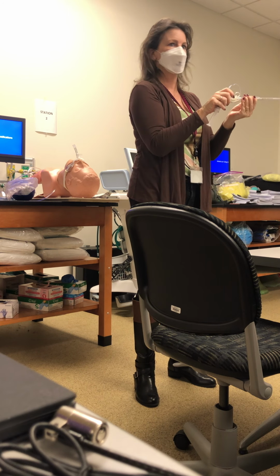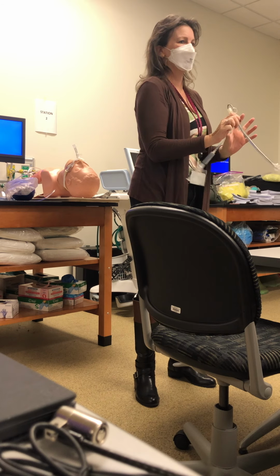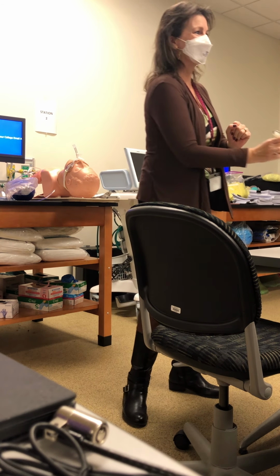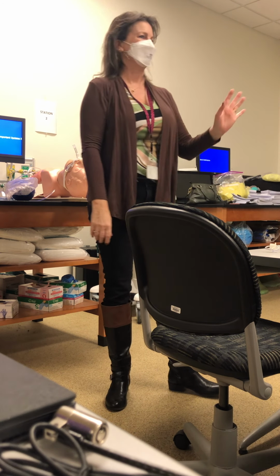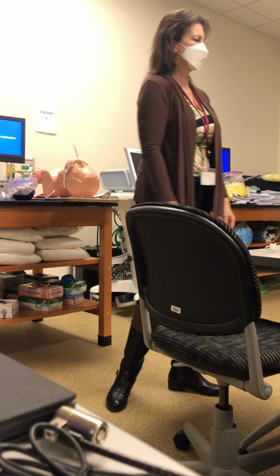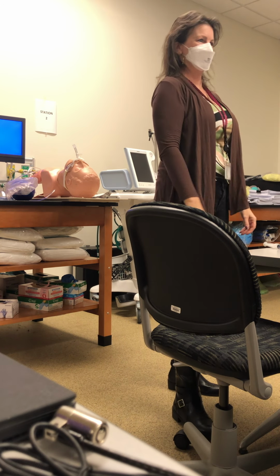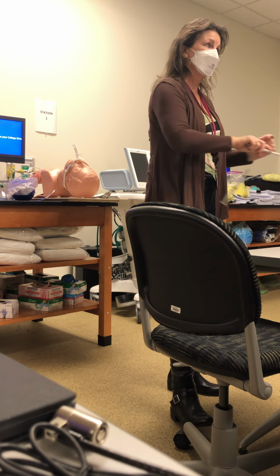We're just going to be touching the upper part, okay? If we wanted to put this down so that we can get our other equipment ready, we're going to put it back in its sleeve. Never put it on the bed, which I see happen all the time. Okay, physician tries to intubate, he can't intubate, and he puts it down on the bed. Okay, full of secretions, just going into a sterile environment. Put it back in the sleeve.